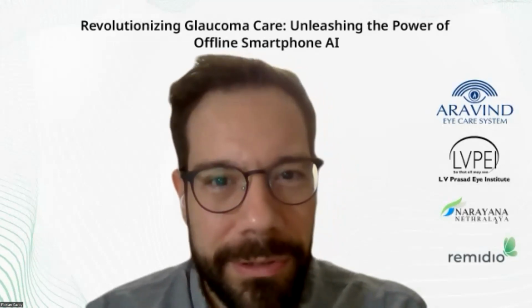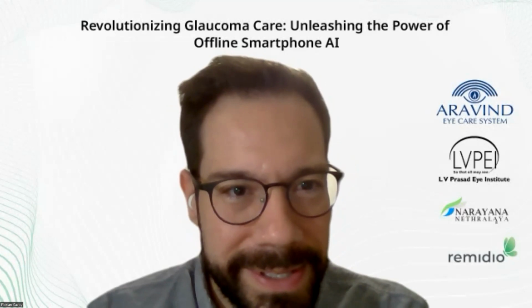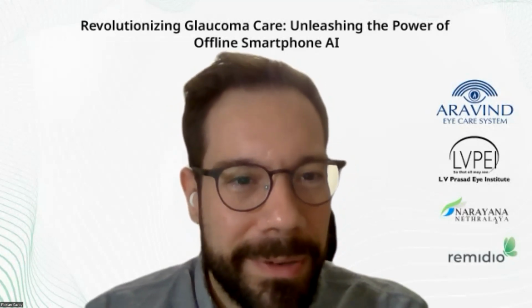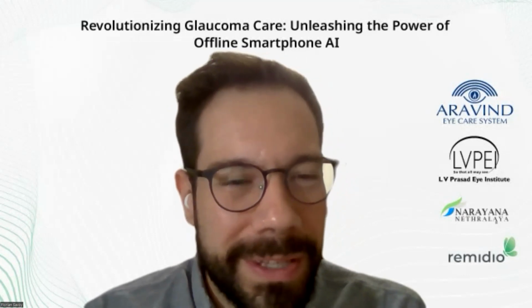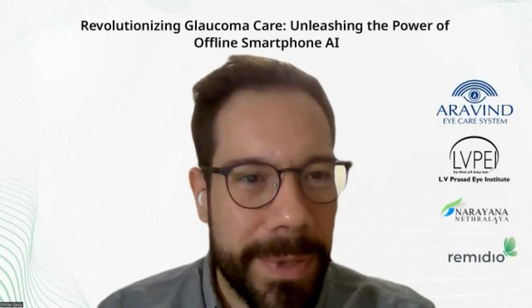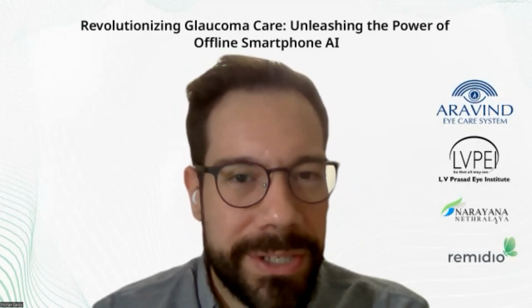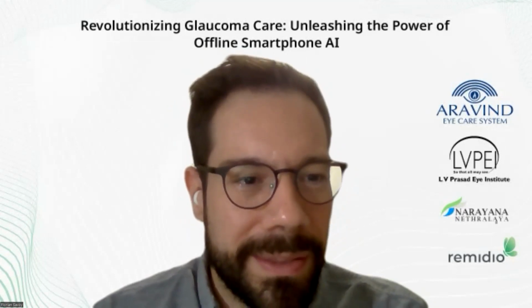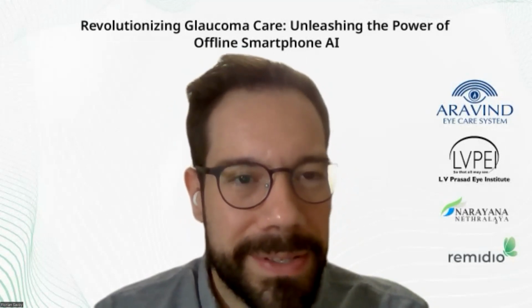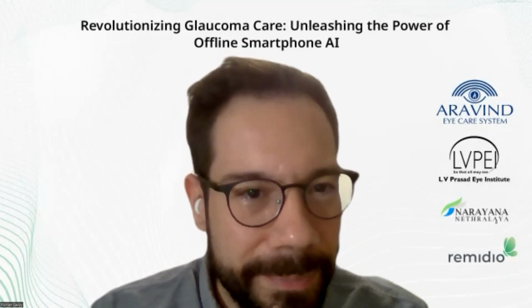But there are a few general trends out there. It depends on the complexity of the task. For example, in the case of diabetic retinopathy, if you do a yes or no, you have all the different stages that go from a few lesions here and there to a big bleed in the image. So it's actually a wide range of cases to be covered within the positive section. And the more you narrow down, the fewer images you need.